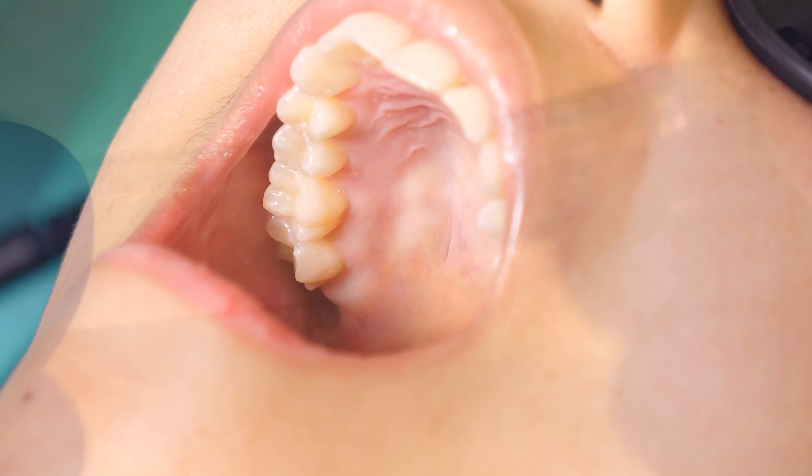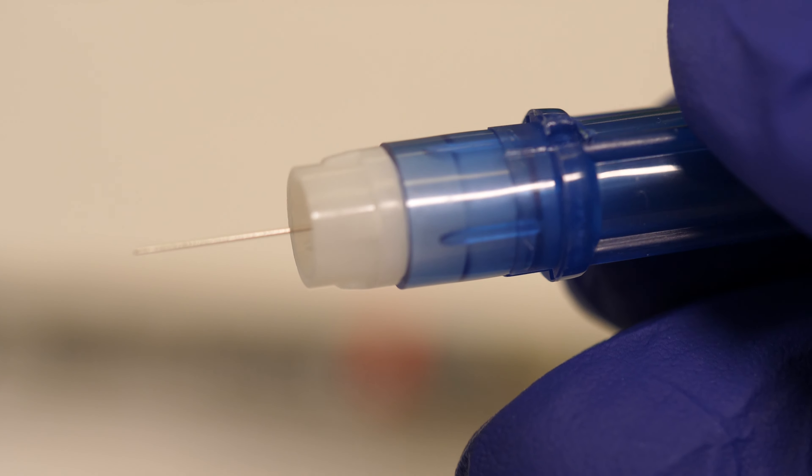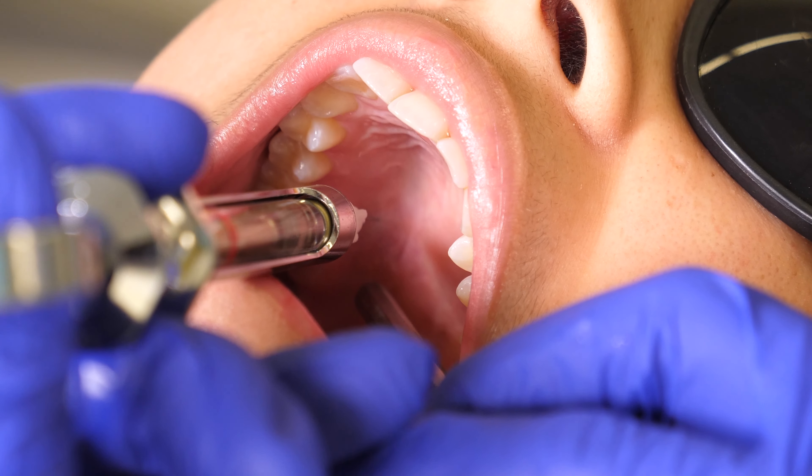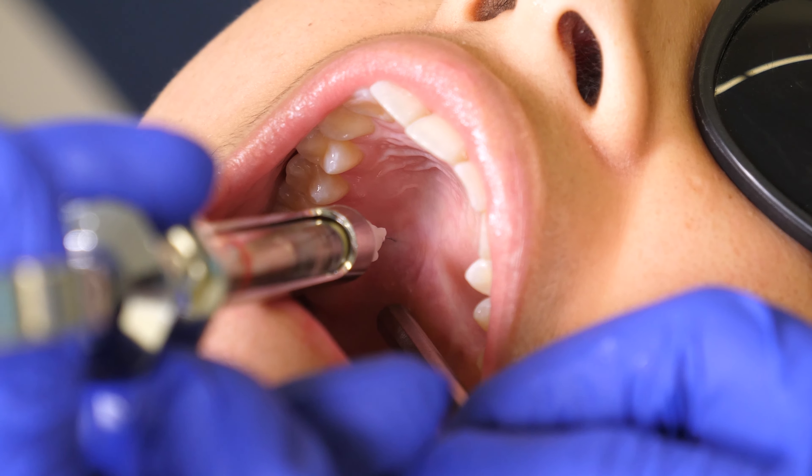For the Greater Palatine Block, it is recommended that you use a blue 30-gauge short needle. The insertion depth will be 2-3mm, as the palatal soft tissue is thin and closely attached to the underlying bone.